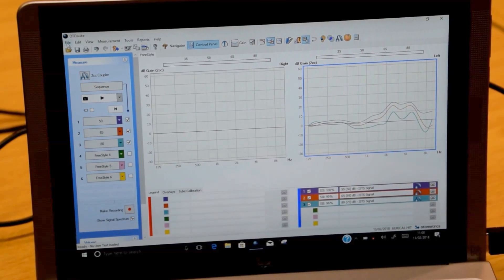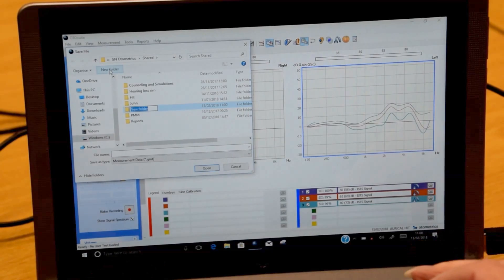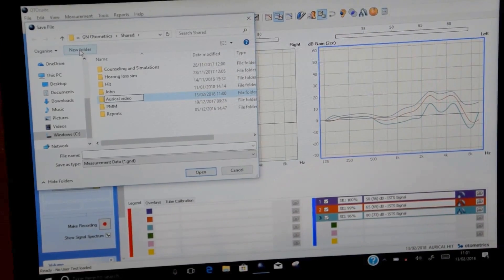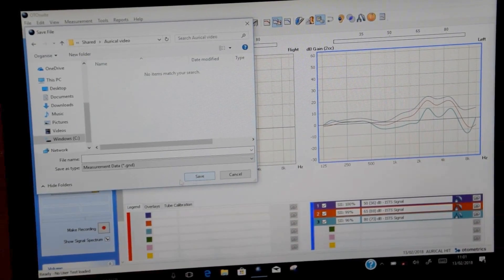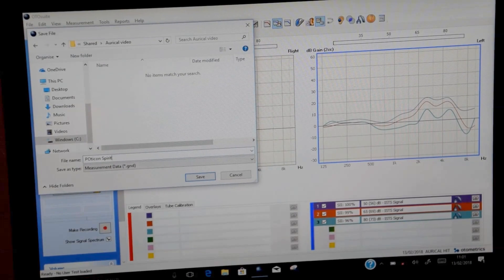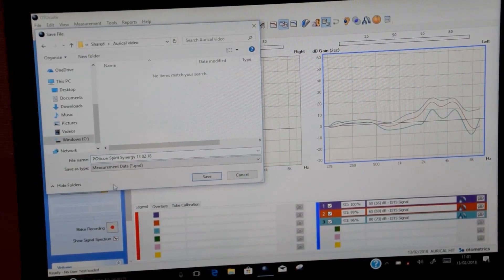We're now going to store that curve by going to File, Save As. I'm going to create a new folder which I'm going to call Aurical Video — this could be the child's name, could be the child's identifier, whatever you feel is appropriate. So we now open that folder and put a sensible file name: Oticon, and the date. So we save that file.